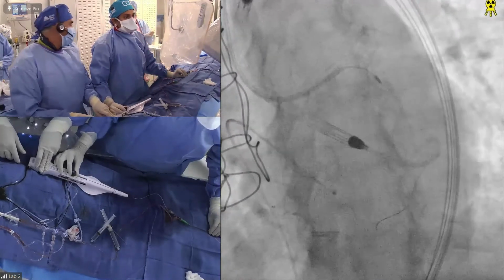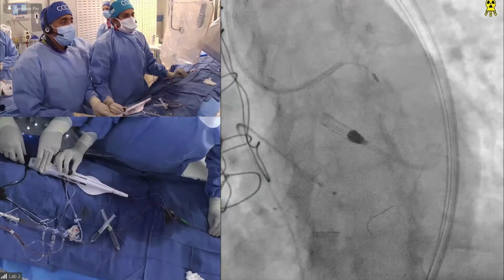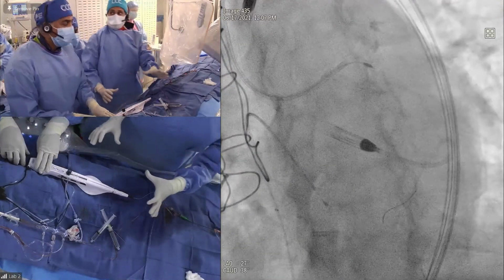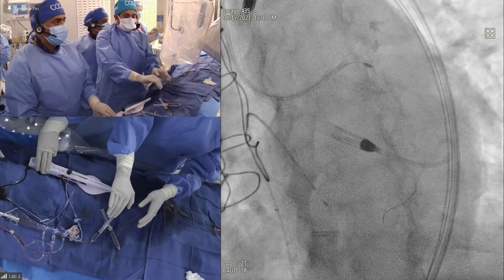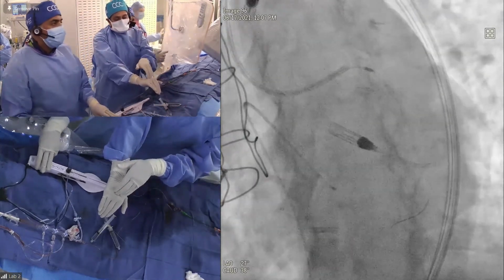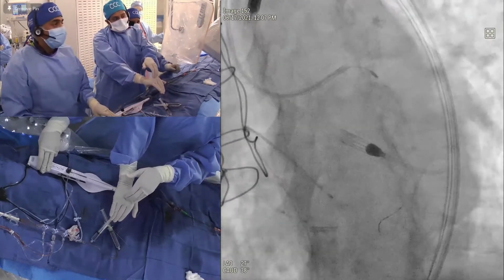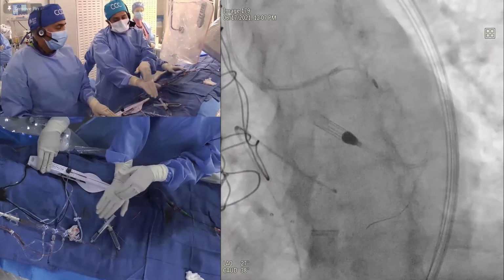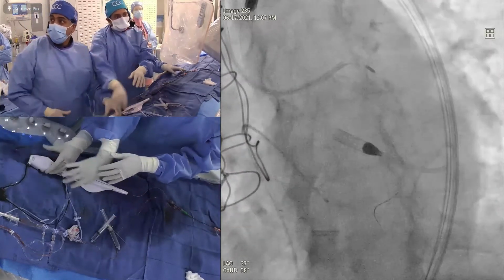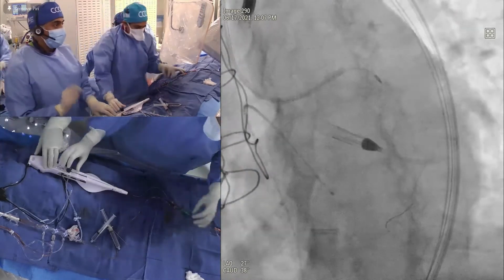Yeah. Changing the wire position too is important. What Nitin is saying, he's changing the wire position. So just to make it clear, you have a circumflex with the wire curved like this, and we are going with the rotor burr. You see here, this angle that we have created can cut the rotor wire. So what he's trying to do, if you see here, brake release, and he's trying to move the rotor wire a little bit forward, backward, changing the position that stresses.